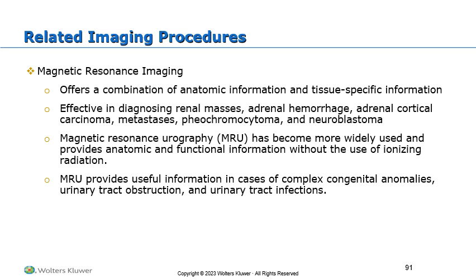It doesn't have as much real-time functional information often as our sonography does, but the quality of the images it provides is a great global view, kind of like CT, much less patient dependent than we are in sonography. The other benefit of MRI is that it has no radiation. It's completely magnetic. They do provide contrast sometimes, which is a risk, and then the expense is pretty high.